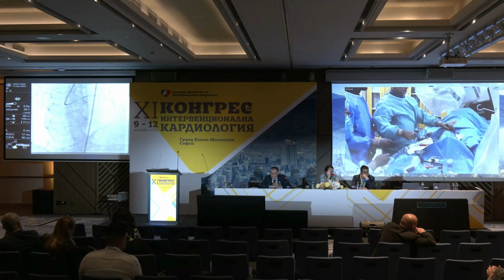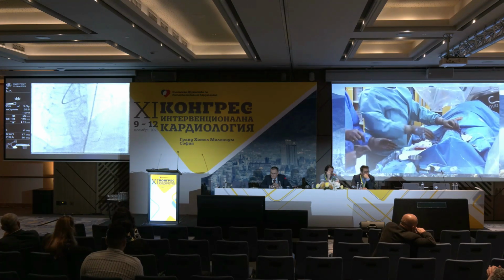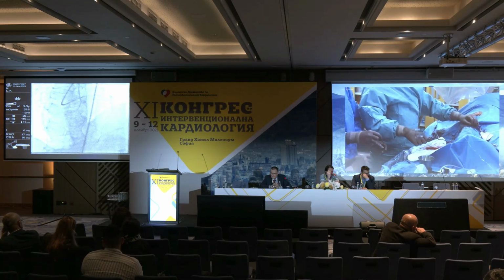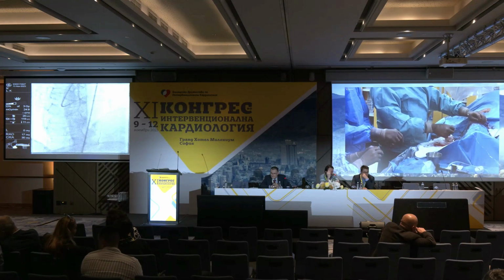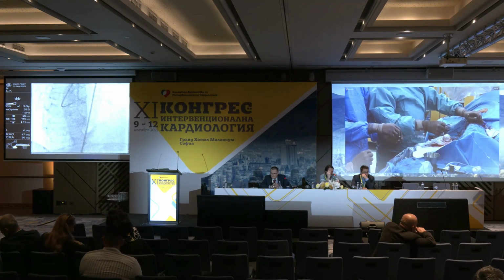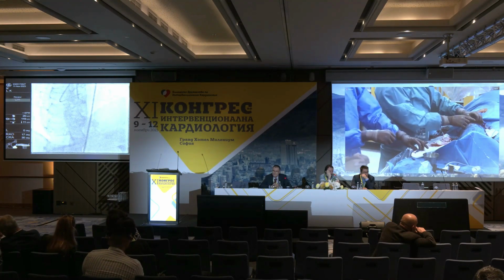During that, you'll see that the antegrade guiding is going, the microcatheter might jump in. Here we have zero resistance. When we see the radiopaque tip, it's there. Then we will retrieve both of these together to avoid any tension in the collateral, as you will appreciate. Okay, that's good.